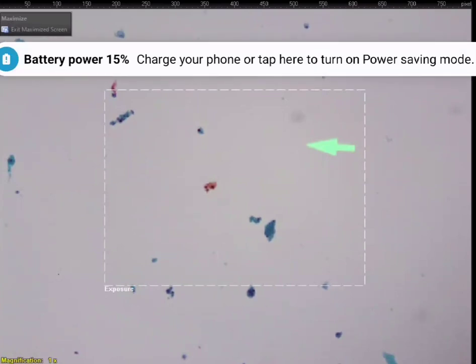Exactly. But sometimes it just says neck node. Neck is a really funny site because sometimes it can be salivary gland. It could be thyroid. It could be muscle.